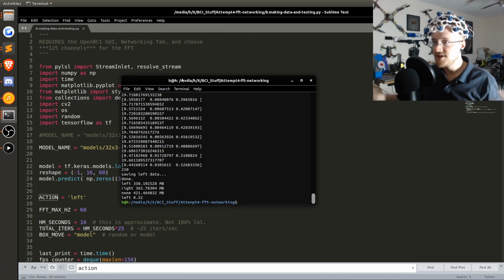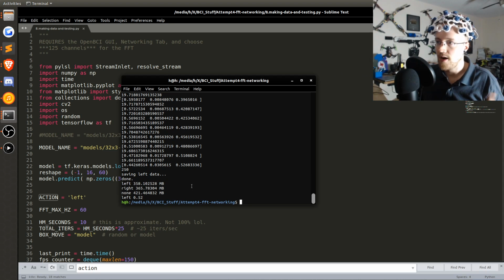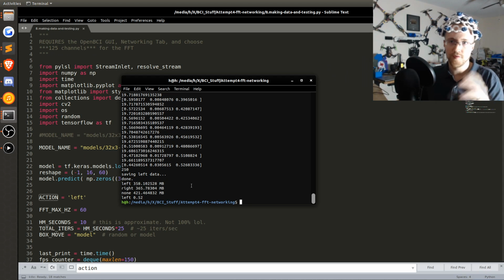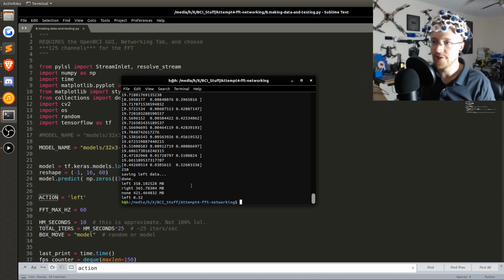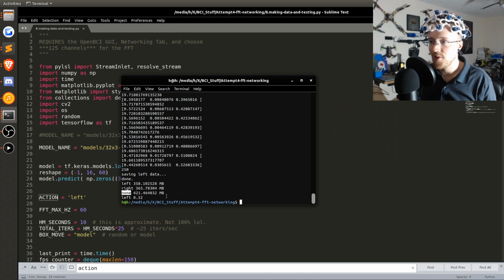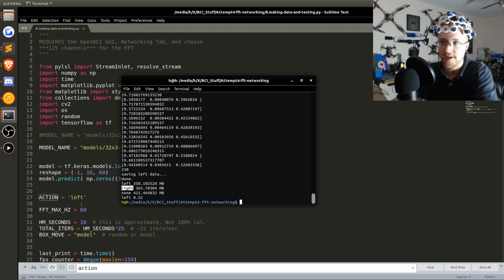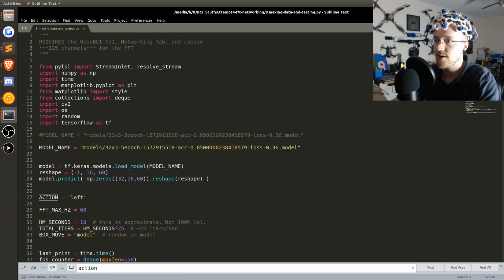Okay, decent. Basically what I get here is this is how much data I have, just so I know where I'm at. Obviously, that box is what's able to move, so I'm thinking left. The hope is that that box continues to move left. There's 3 action choices, left, right, or none. We can see here that left was the predicted action 52% of the time. I do actually collect more information, I just haven't started printing it out yet. But what happened there was probably mostly none gets predicted a lot. So obviously predicting none is much better than predicting right, at least. And as you can see, we did move beyond that middle thing. So that was okay. Let's go ahead and try right.